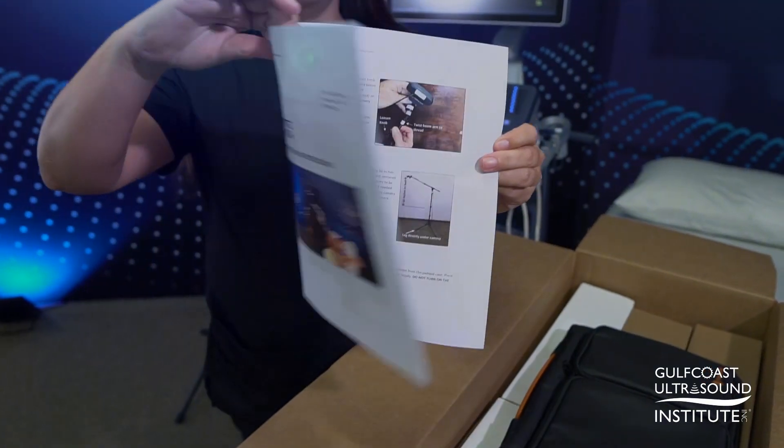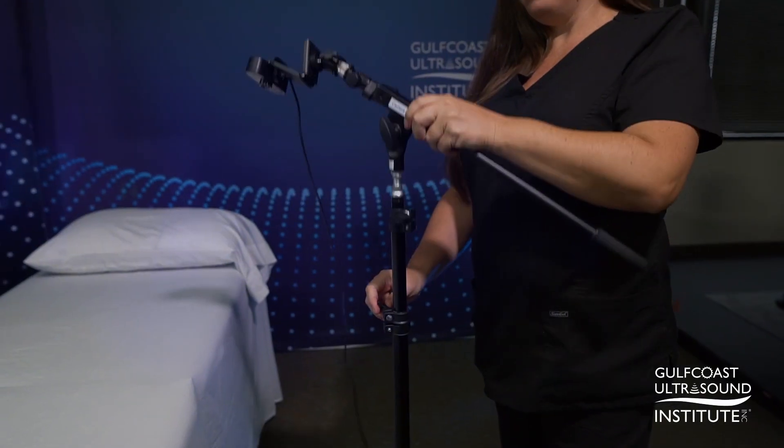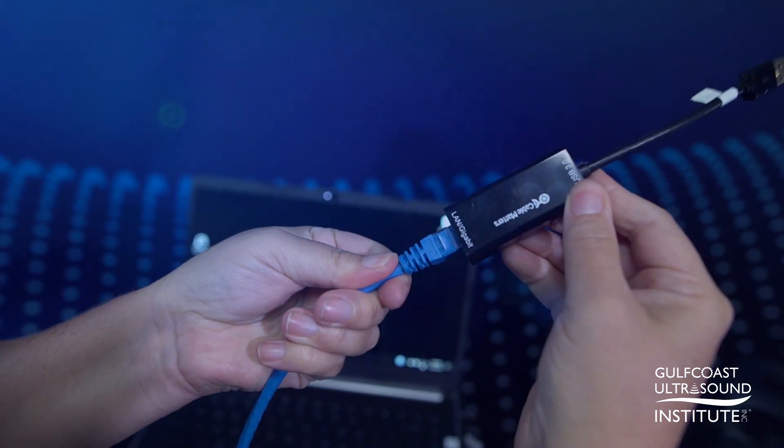The Remote Coach Kit will arrive at your doorstep with step-by-step instructions for quick and simple setup and breakdown, and best of all, can be utilized by anyone, anywhere. All you need is a high-speed Wi-Fi or Ethernet internet connection.